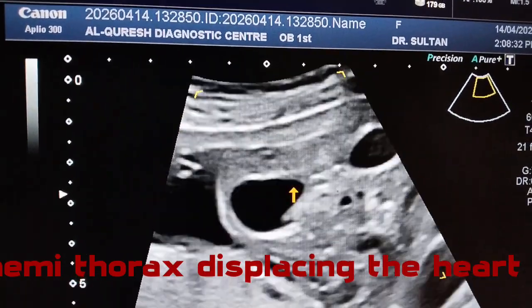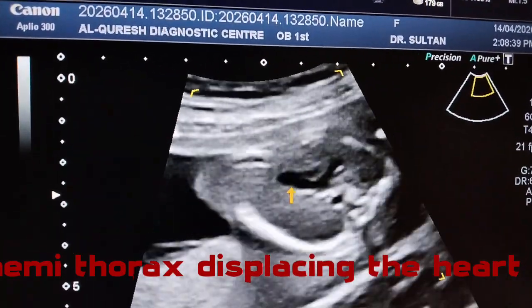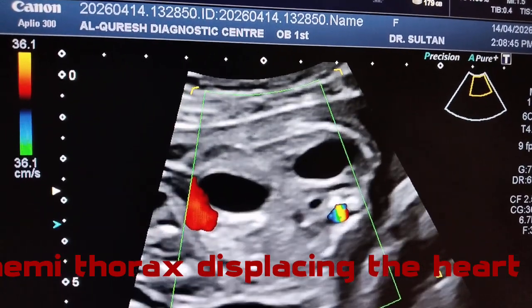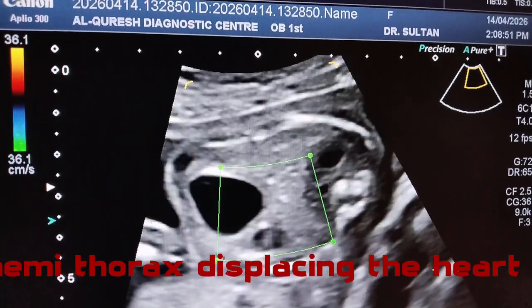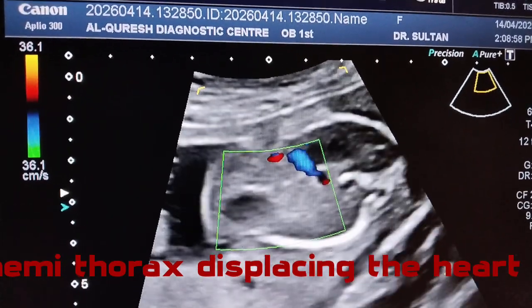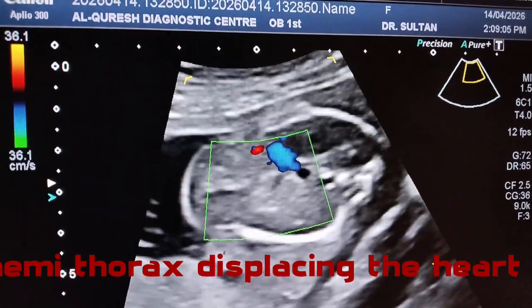And other differential may be the malrotation, but in the malrotation we can appreciate the whirling of the mesenteric vessels at the upper abdomen, which is also very difficult to see, but we can see it. So I have not found such findings in this case also.